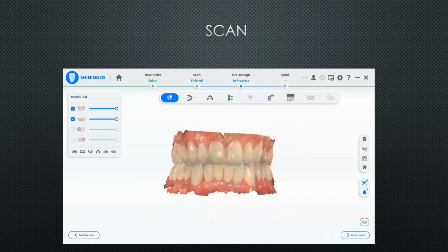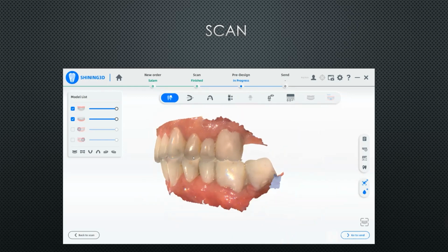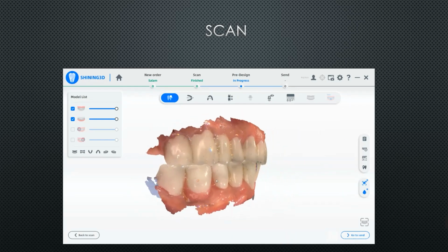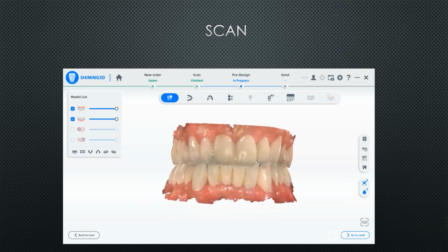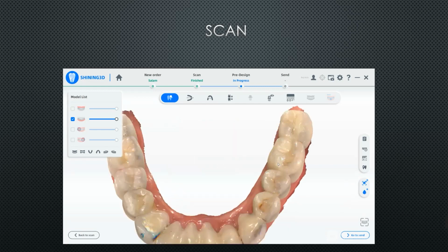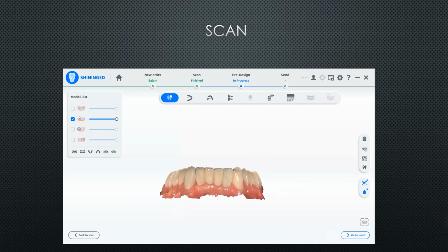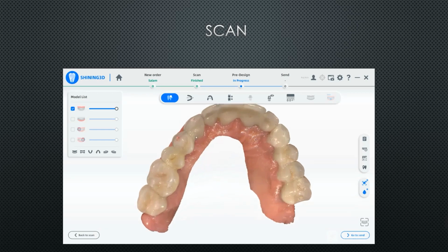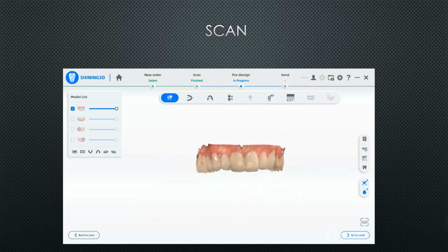If you look closely, the teeth are long. We didn't reduce a lot from the teeth to have interocclusal distance. We used something called the freeway space, which we don't use actually. We used it, and we elevated the vertical dimension. If you look here, maybe the 6 in normal condition needs more reduction, but I didn't because I have the space for it. So there is no need to reduce more from the length of this tooth.